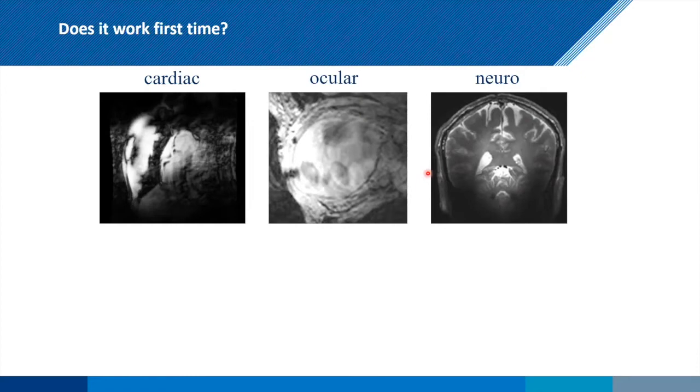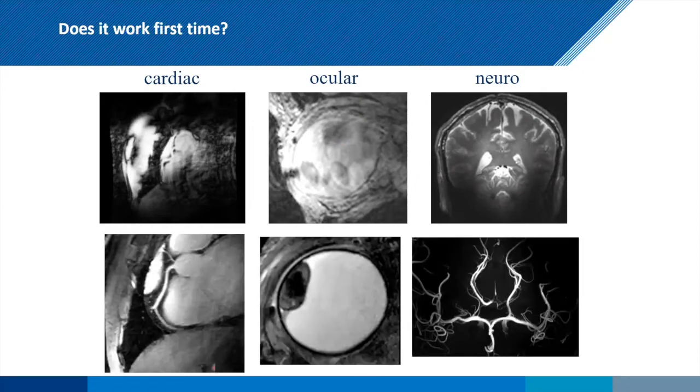But if you do that, then you can end up with images like this, where we're looking at the inside of the heart, and we can see very good depiction of the vessels. This is an ocular tumor here, so we have excellent 3D images, showing in this case there's a necrotic core inside that tumor. And then neurologically, of course, we can get whole brain coverage here, in this case just for an angiogram.